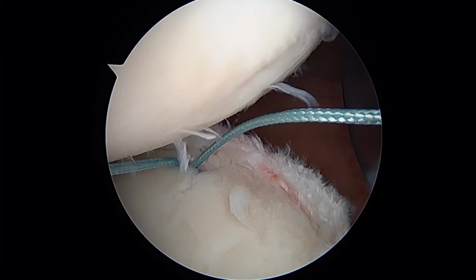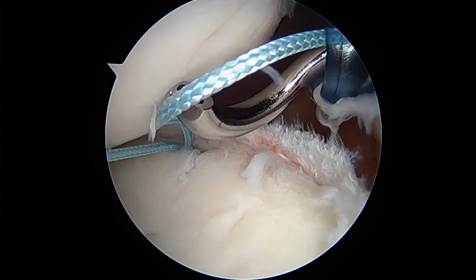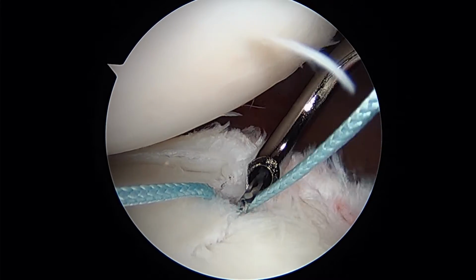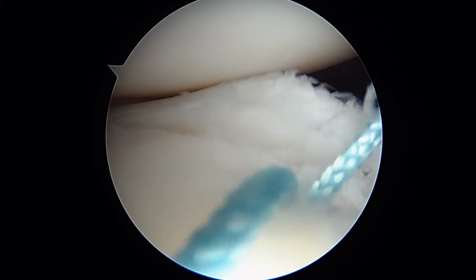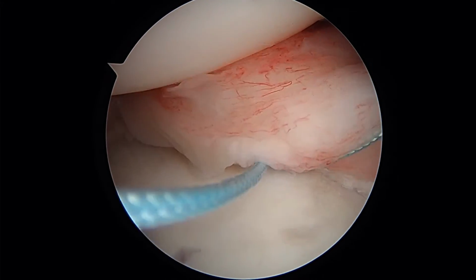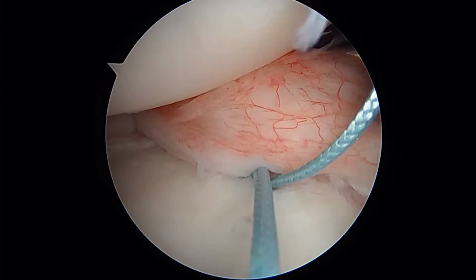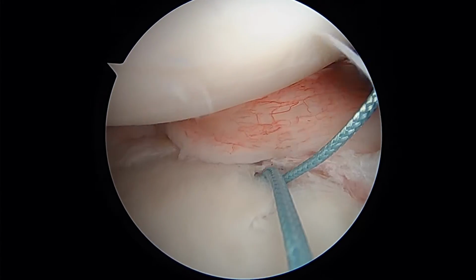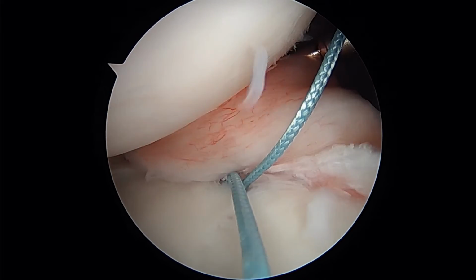Okay, so we're getting ready to start to plicate the capsule. This hook that you see coming in is a suture hook. It's loaded with a black wire called a super shuttle. You can see it there. Put the grasper in the front. So we're going to start here. We're going to rotate, and we're going to go into the capsule right about here. And then once we make sure that we've gotten through once, we'll get that through and show you in just a second here.